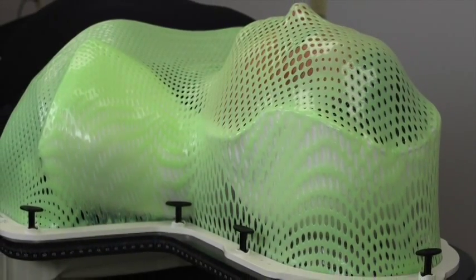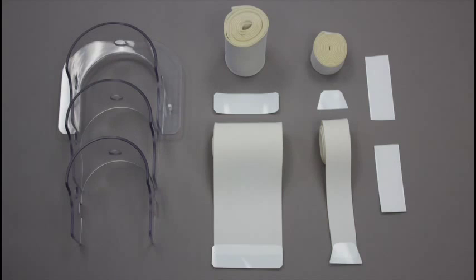The Clarity shell system consists of a moldable shell cushion formed using one outer and two inner shell molds, two self-adhesive Velcro strips, two neck straps, and two shoulder straps.